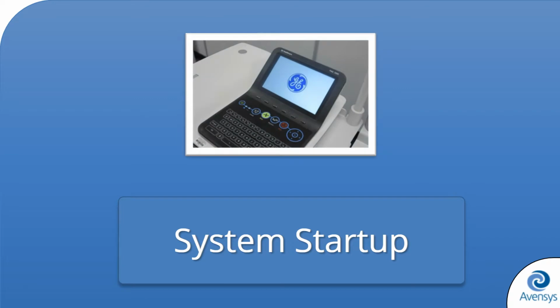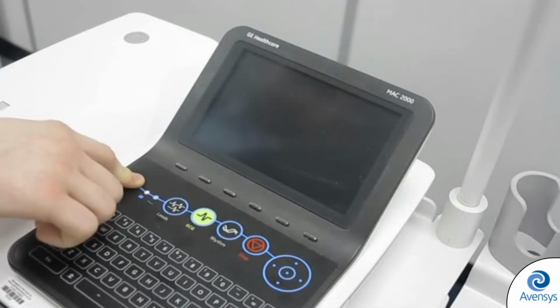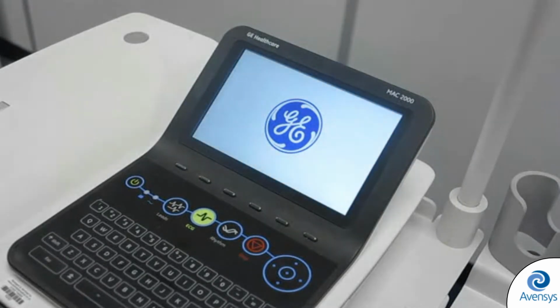System startup. Upon starting, the unit carries out a self-test. When the self-test passes, the unit is ready for acquiring an ECG, as indicated at the top left-hand side of the screen.